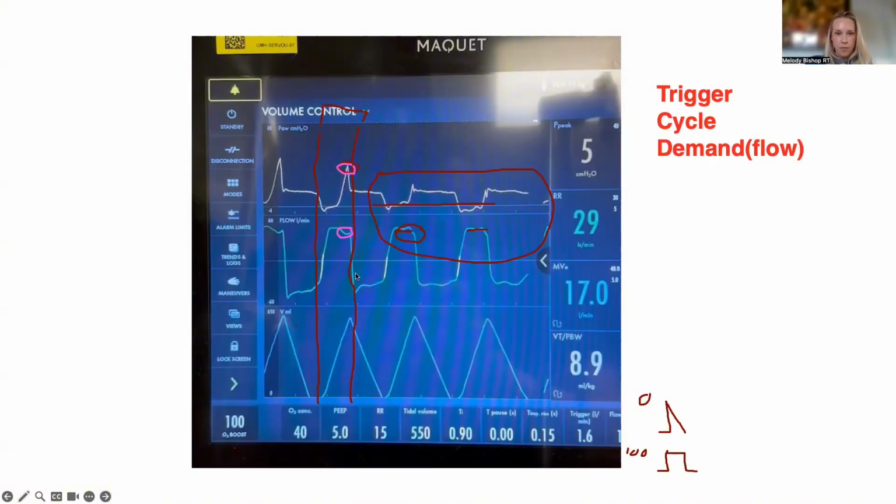No, I think you're right. While 0.9 of a TI isn't that high, maybe on the higher end of normal, it's not like 1.5 seconds. What does RT school tell you is a normal TI? Do they give you a number? So for an adult patient, it's technically 0.8 to 1.2. So even by that, it's right in the middle.